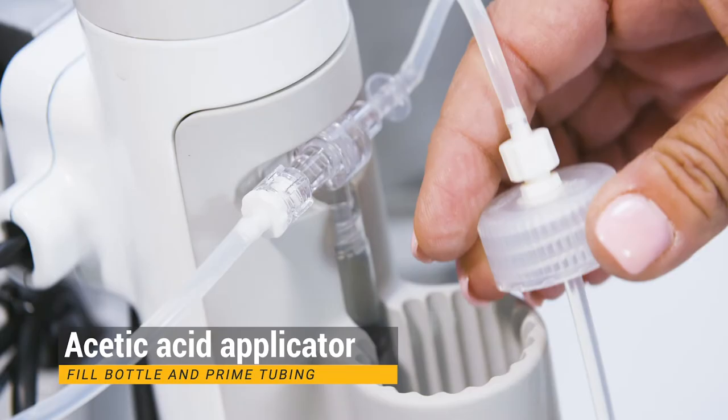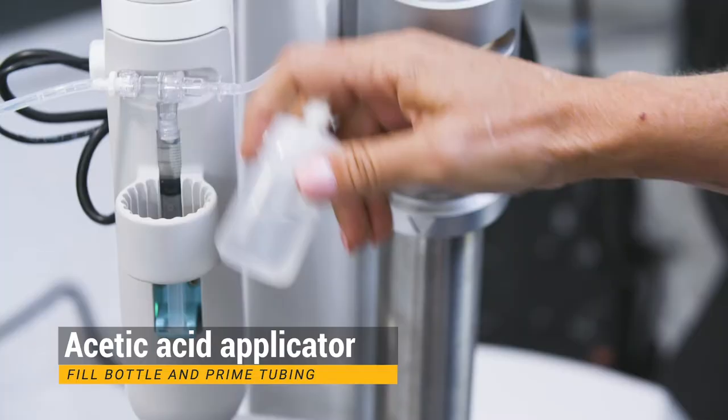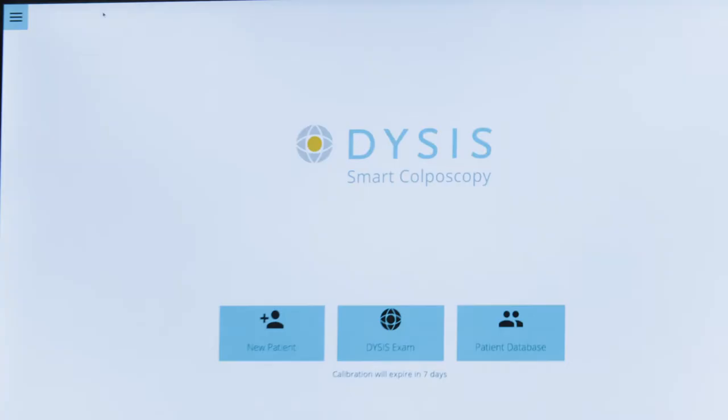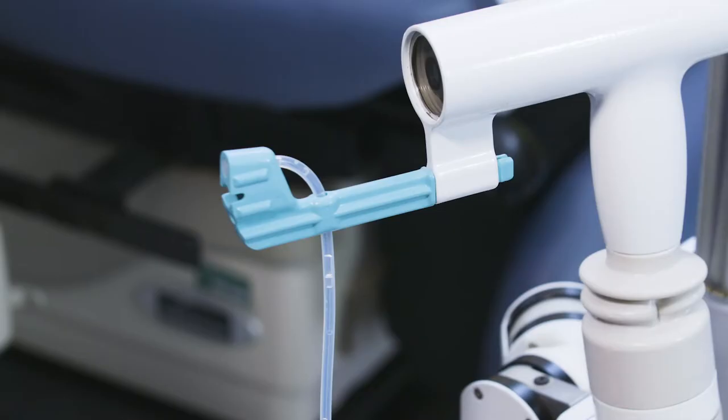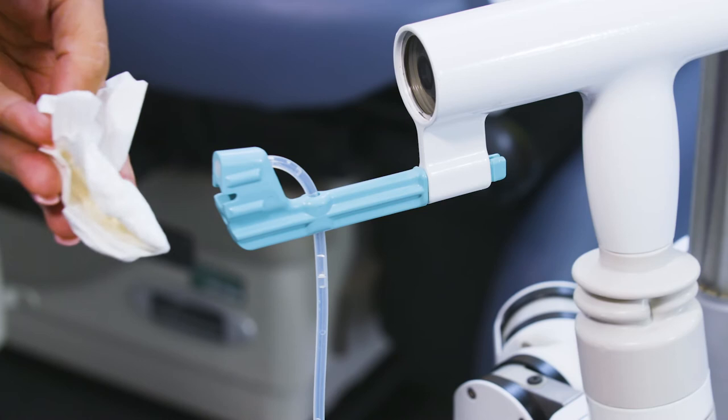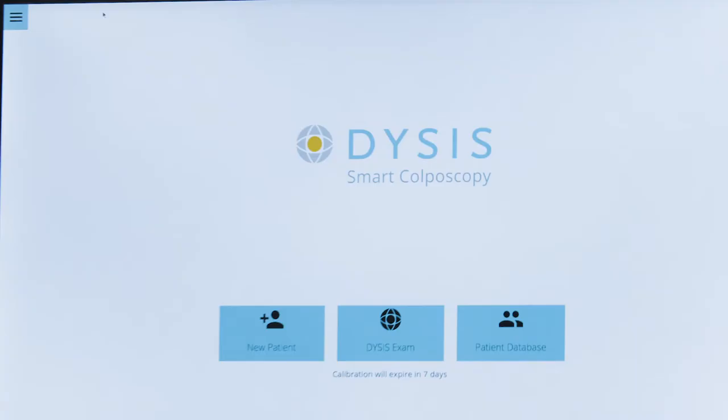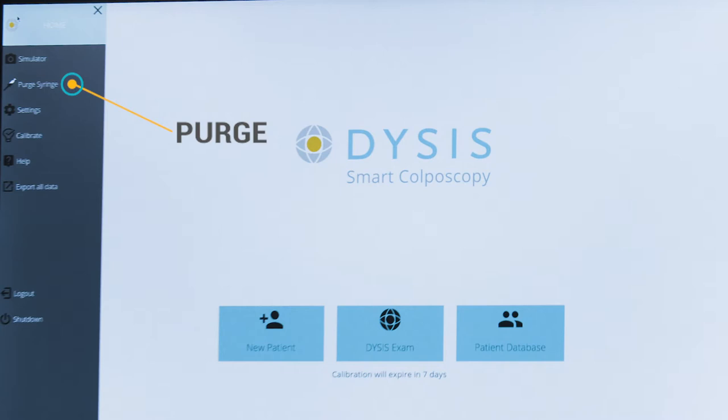To prime the tubing to remove any air, select the menu button from the home screen. Place a paper towel in front of the diffuser located in the front of the speculum connector and press Purge. This may need to be repeated several times to remove all the air.